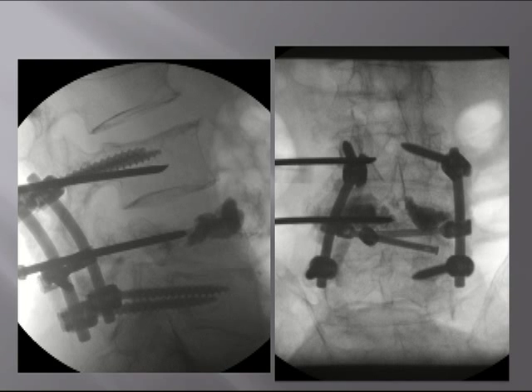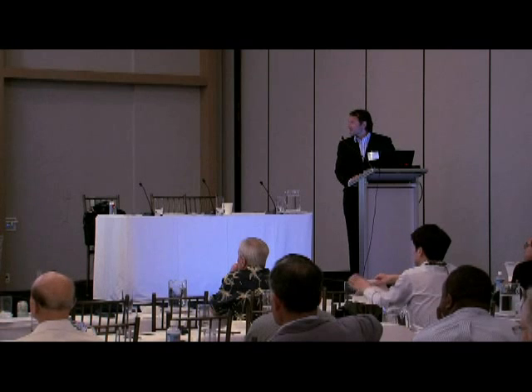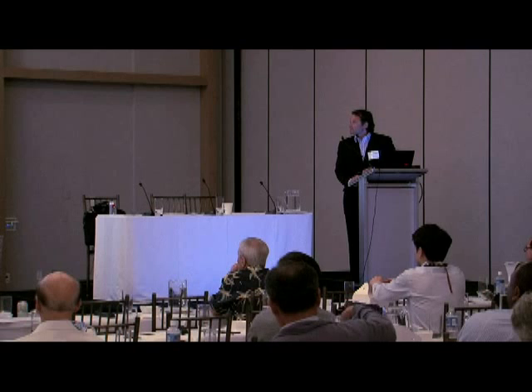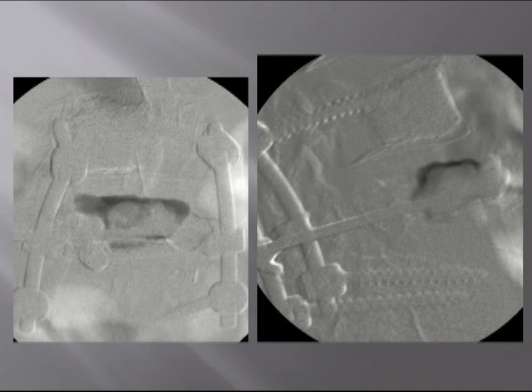Unfortunately, posterior fusions a lot of times don't work on myeloma patients because of the loose bone, and the stabilization fails. So it's a very far lateral approach coming into the center of the vertebra and creating a cavity, and then following that with very slow filling of the cement, and letting it grow from the center to the periphery, which can be achieved with a very high viscosity cement.